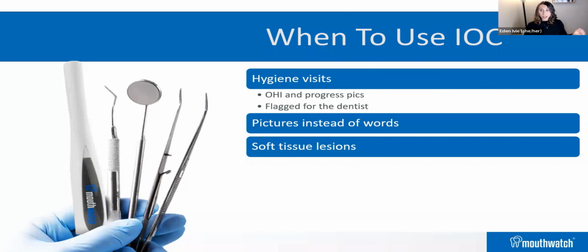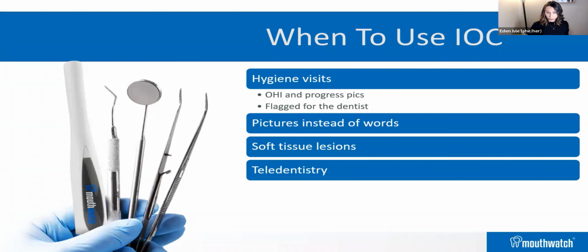Soft tissue lesions. We'll talk a little bit more about this, but for documenting and tracking soft tissue lesions, intraoral cameras are critical. Teledentistry. If we are working with a provider who's in a different location, those images are the eyes of that remote provider. So we have to be using intraoral images and getting clear diagnostic images.